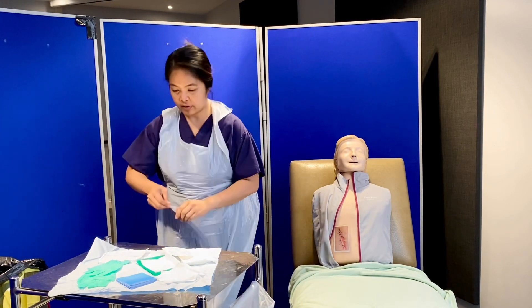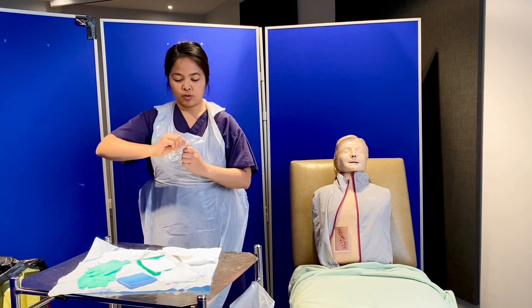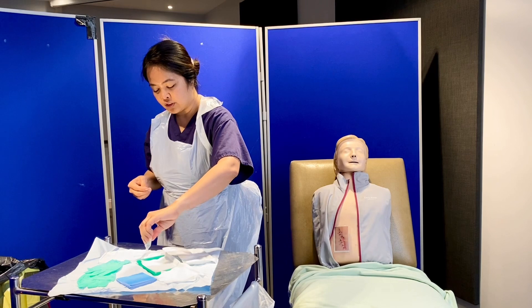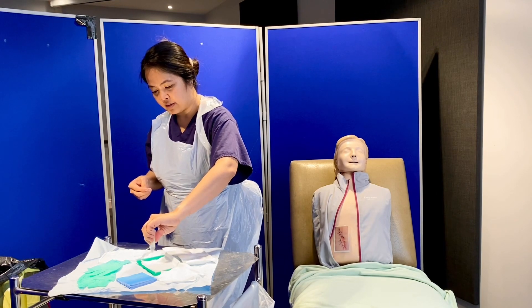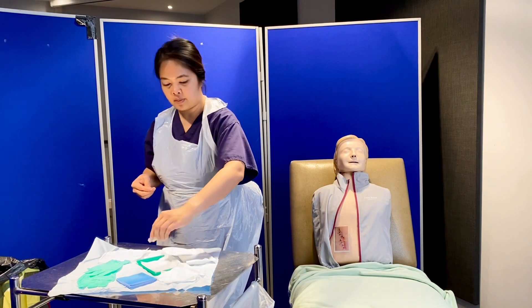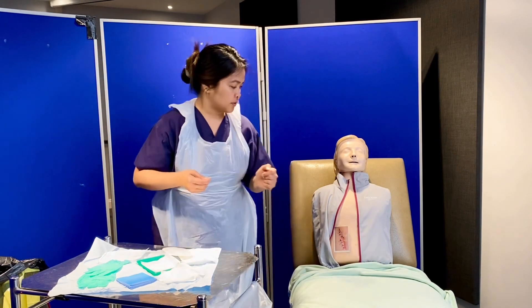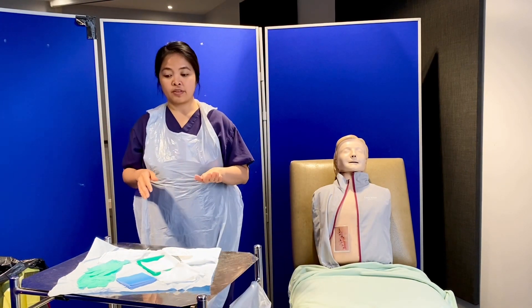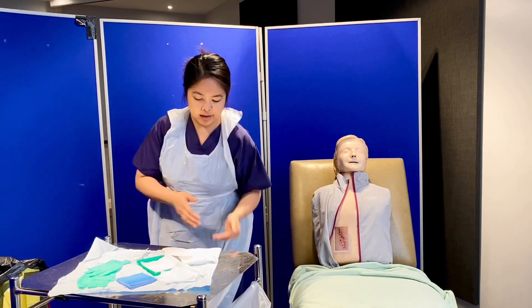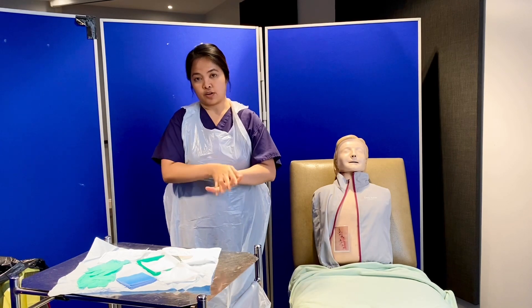I open the normal saline and pour about 5 small amounts into the basin to clean it. Since I'm satisfied that everything is in my sterile field, I'll do my hand hygiene before putting on my sterile gloves.